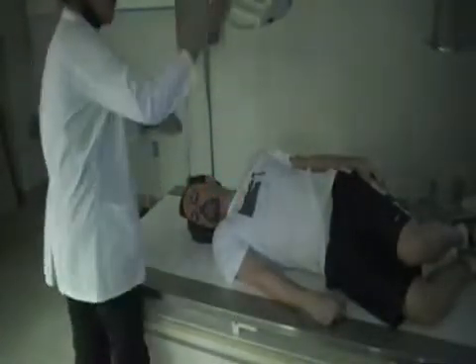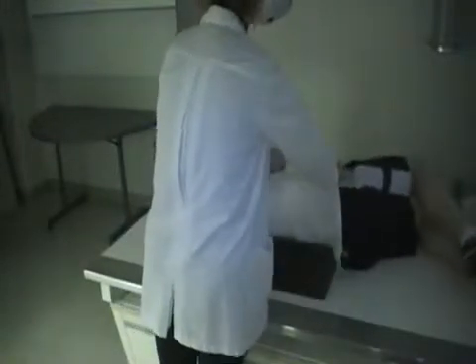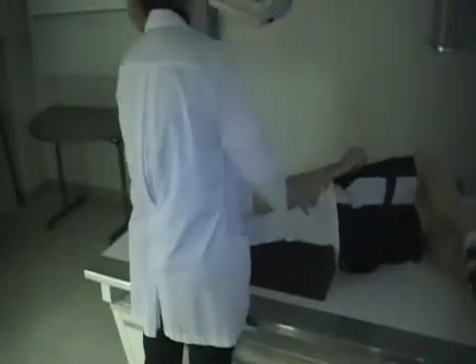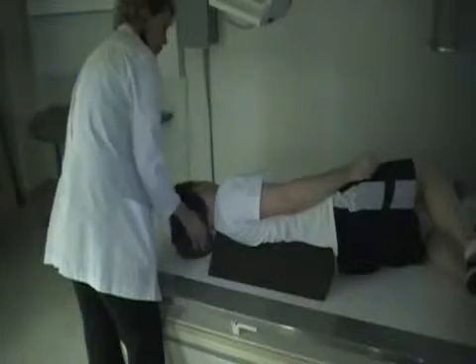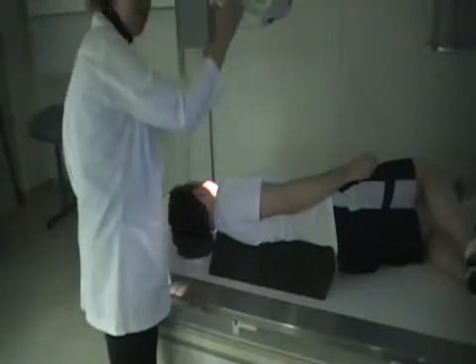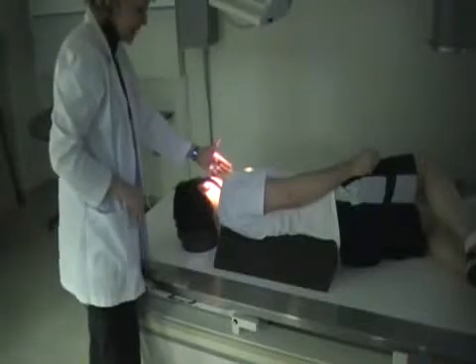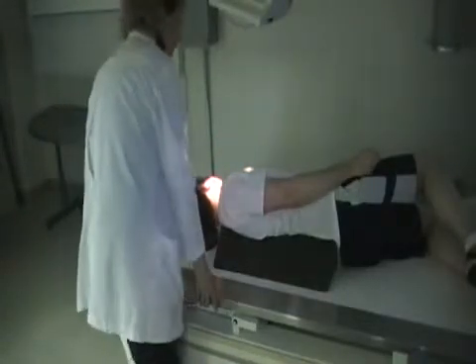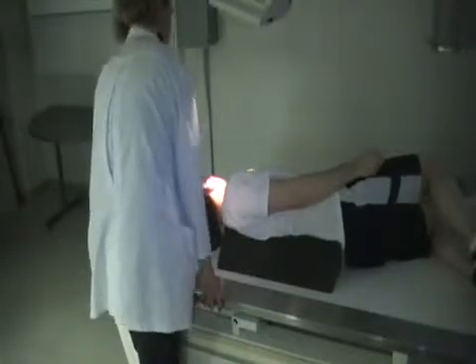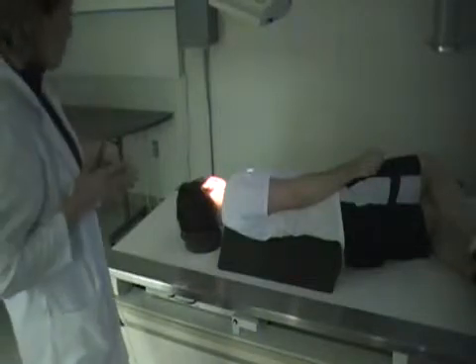Okay, now for the left oblique, we're going to have the patient turn to the left about 45 degrees. Okay. Lean your hips back. There you go. Relax that shoulder. I'm going to turn the head just a little. Okay, it's the same angle as before, 15 to 20 degrees. And you just want to get centered over the mid-neck, and you want to check out that thyroid cartilage and have your line cutting across that. And again, you're at C4 at this level.